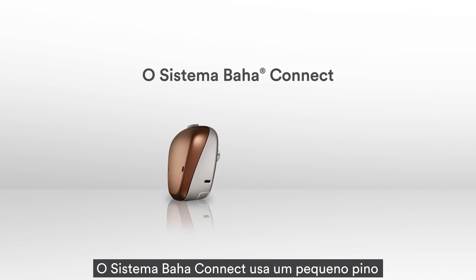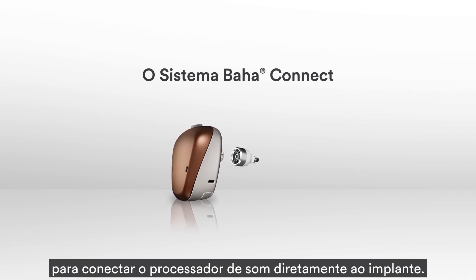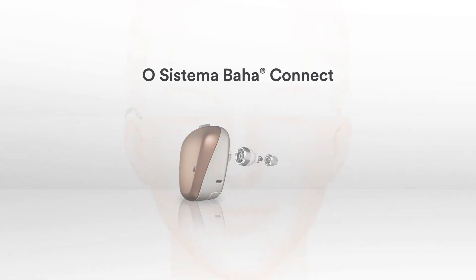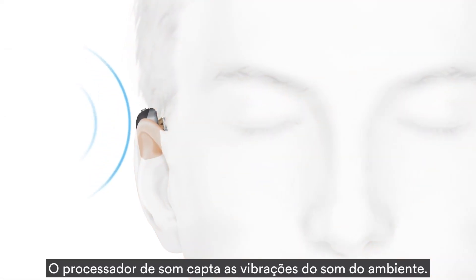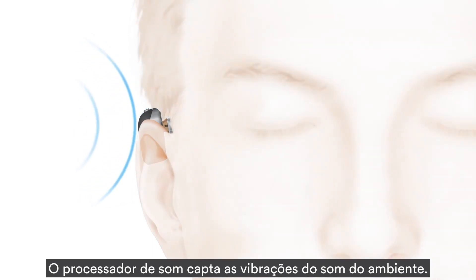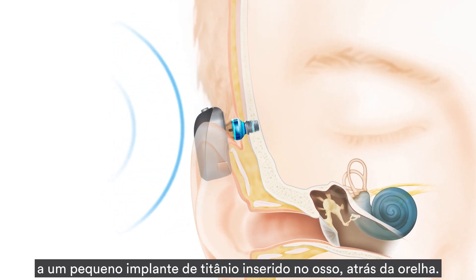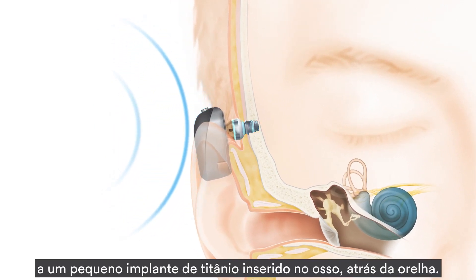The Baha Connect system uses a small abutment to attach the sound processor directly to the implant. The sound processor picks up sound vibrations from the environment. The sound vibrations are transferred through the abutment to a small titanium implant inserted in the bone behind the ear.